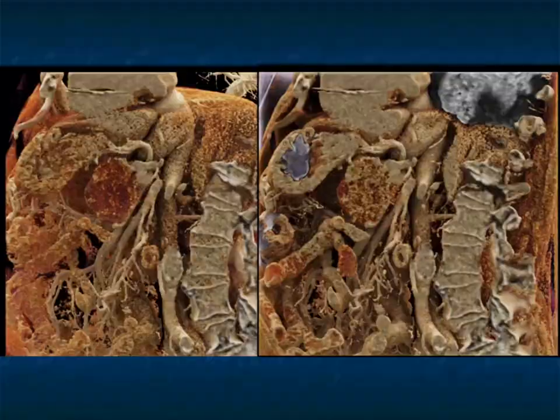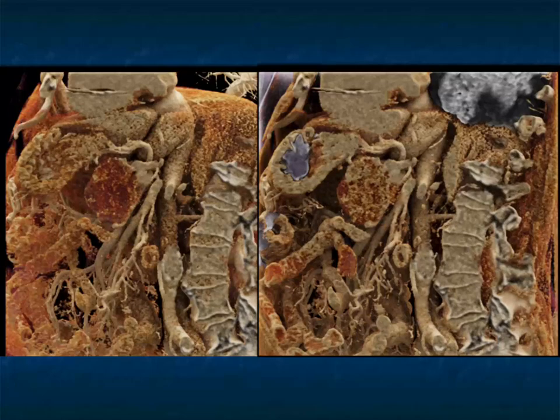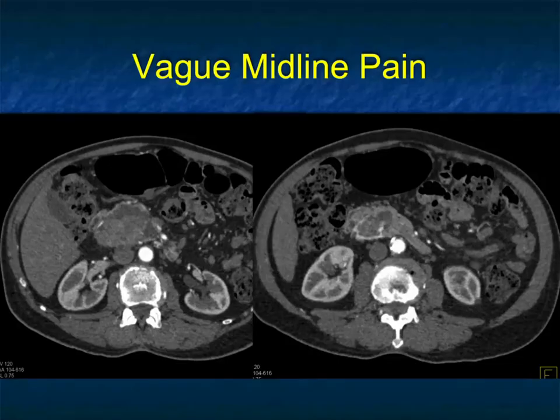Here it is again from a sagittal view. Sometimes the sagittal views are even better at showing the septations and the multiple small cysts. Often it's about choosing the best view. When you look at the axials, coronals, sagittals, and 3Ds together, you may have the best information possible.